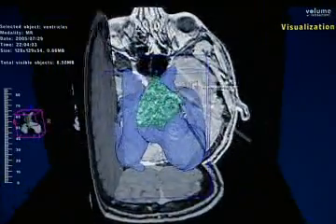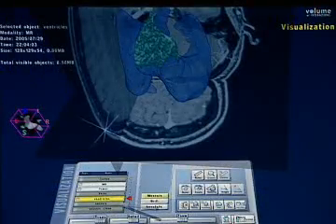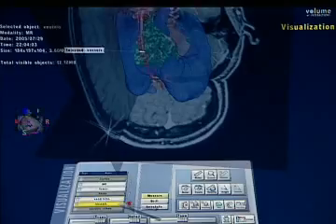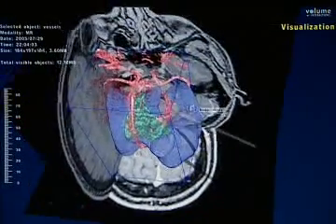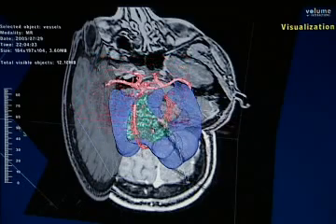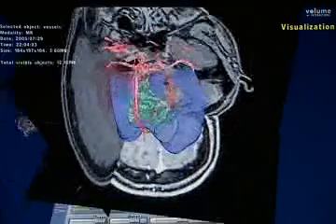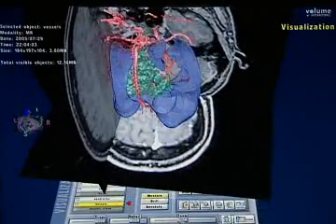Here you can see the relationship of the tumor to the ventricles, and then he'll put the vessels on afterwards. This is not an MRA — he can abstract the vessels from a routine plus image, including veins and arteries. There you can see the arteries, and then he will do the veins, so you can start getting an idea of the relationship of this tumor to the vessels.